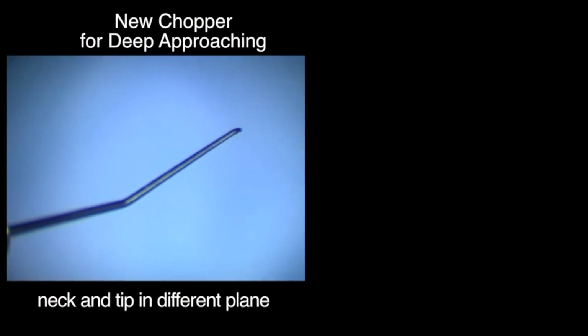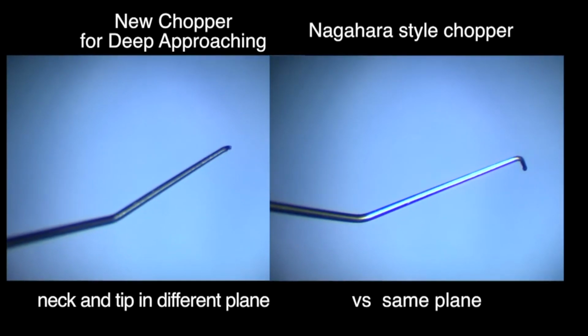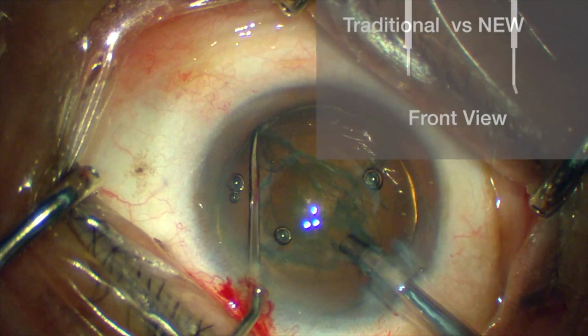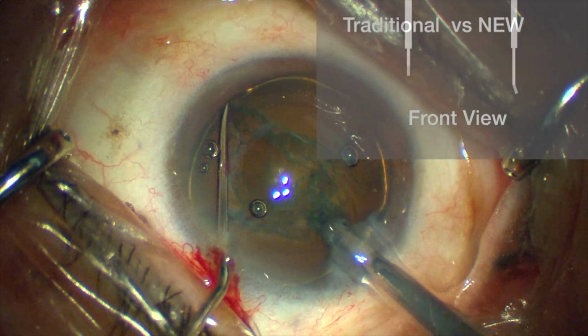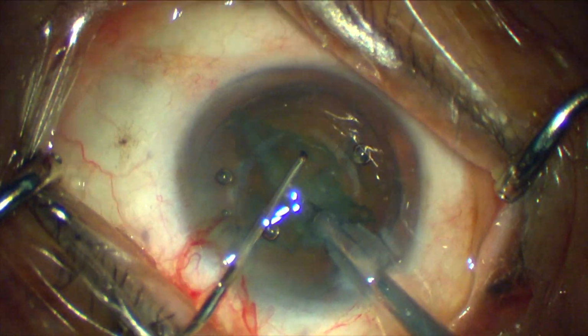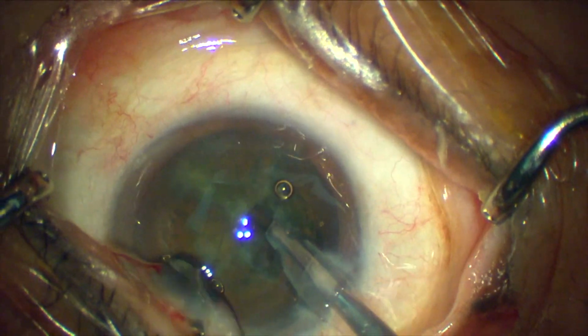And another difference of this new chopper is the tip angulation to the outward with three-dimensional design. It makes easy sliding into the lens equator even with the supinated position of the surgeon's left hand. The chopper tip is vertical even with the supinated and relaxed surgeon's left hand.